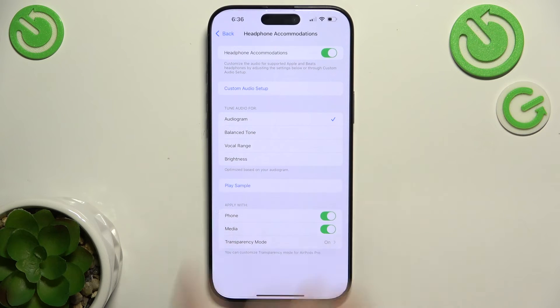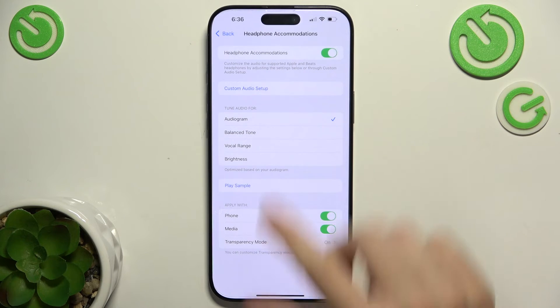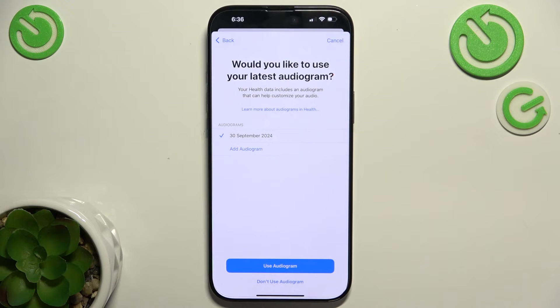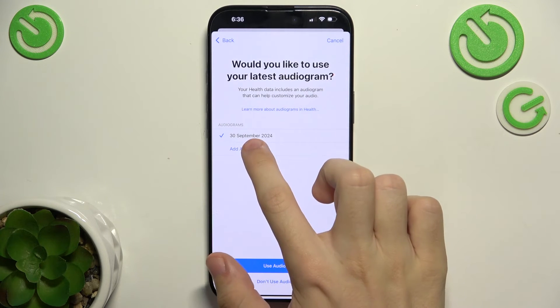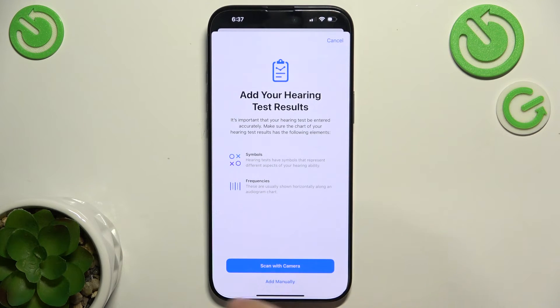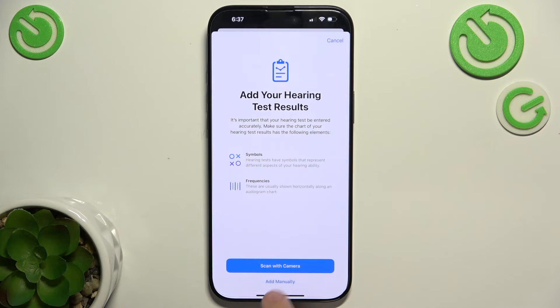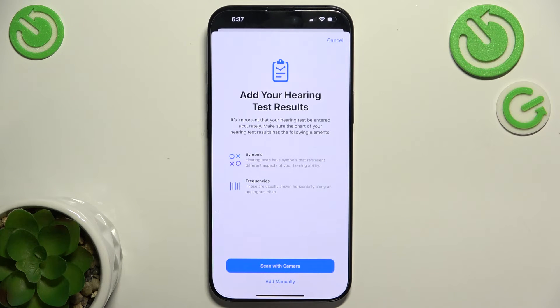To set an audiogram for Headphone Accommodations, go to Custom Audio Setup, then click Continue. Here you can either choose an audiogram that's in your Apple Health or you can add an audiogram. In fall of 2024, hearing tests on iPhone will be available, so you'll be able to take a hearing test on your iPhone using AirPods Pro 2nd Gen.